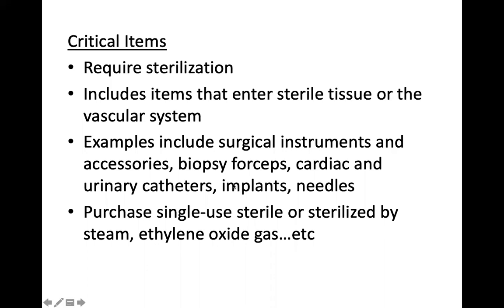So examples of these items like biopsy forceps, urinary catheters, these are single-use items. It comes from the manufacturer, it is marked sterile. Once you break the seal, you use it on a patient and then it is discarded. You cannot use it on another patient, okay? Implants, needles, but for things that can be reused, I've said you need to take them through a sterilization process, okay?